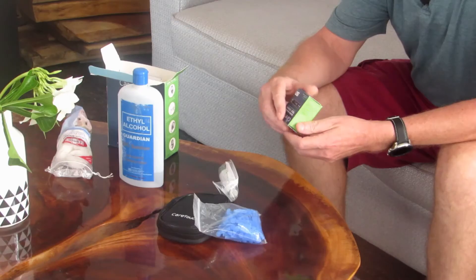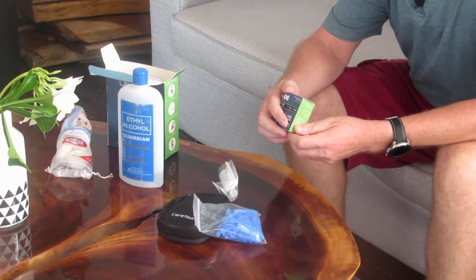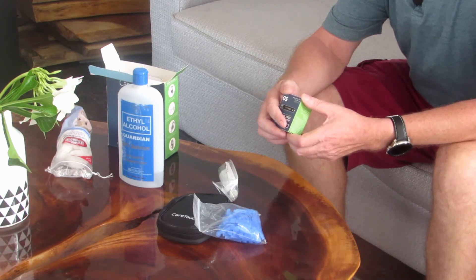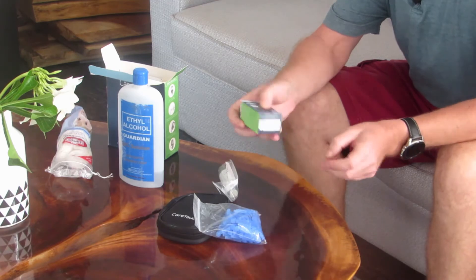Check the test strips the minute you get them — the date will be on the back. The date on this one shows it was manufactured last year and it's good until the 11th of the 9th, 2022, and that's written on the back of the strip box.